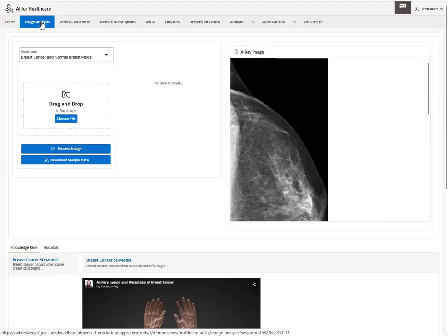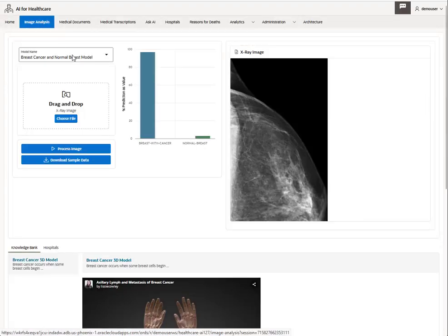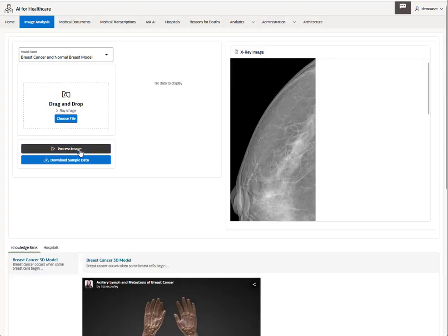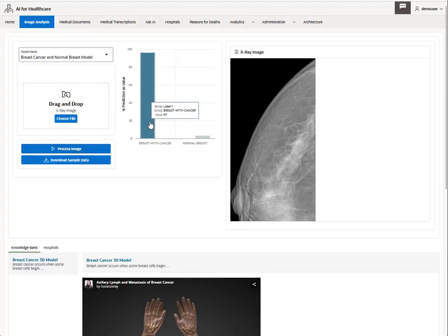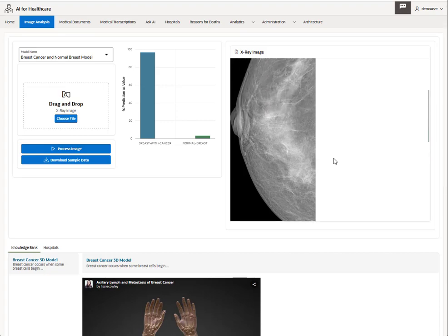On the image analysis tab, you can upload an image of a breast x-ray. The app will process that image, compare against the trained model loaded into Oracle Cloud Infrastructure or OCI, and it provides a percentage or probability of breast cancer. It uses OCI's vision to detect anomalies in tissues that are indicators of cancer, and it will give you a probability score of either cancer or normal tissue present in that image. The left side gives you a probability score of 97 percent, and the right side gives you a probability score of 3 percent. To the right of that shows the x-ray image of the breast tissue.